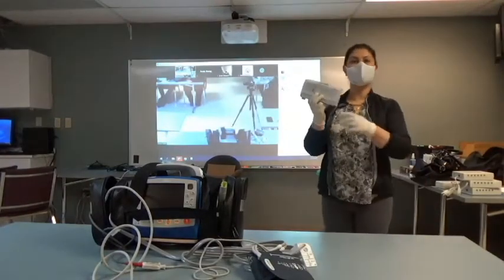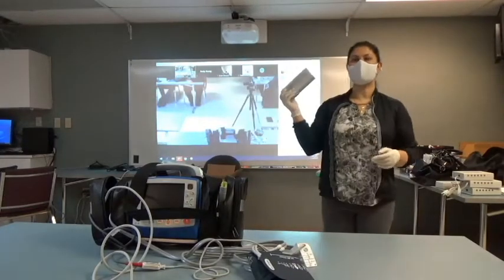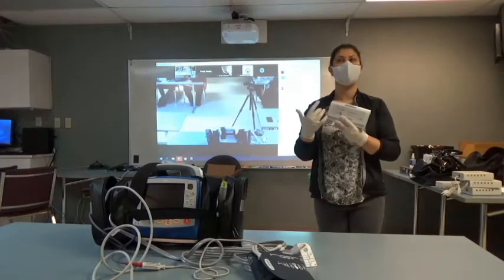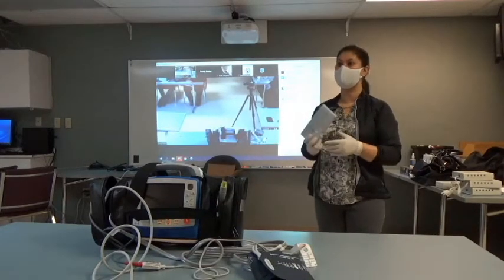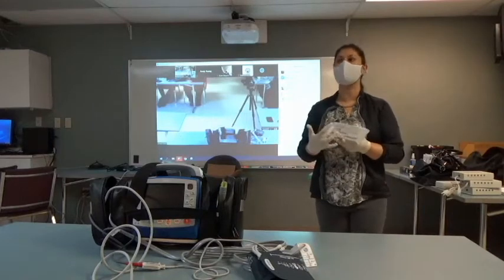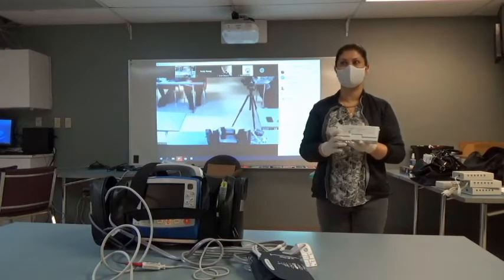Okay? The reason for that is even if this sits here full, it doesn't mean that it's going to get a recondition. And the only way to keep the cells inside this battery going and functioning properly is to visit the base charger on a regular basis. So if it needs a recondition, it can achieve that. Otherwise, the cells inside the battery can begin to die. Okay, so really important that we rotate these.